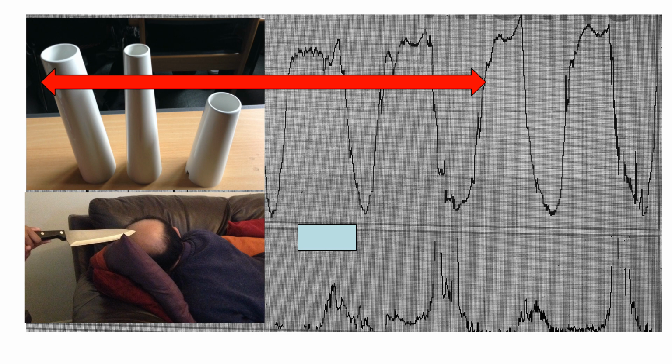This is because many years ago, it was believed by some obstetricians that the skin of the scalp was very close to the fetal brain, and therefore if you take a sample of blood from the skin of the scalp, it reflects the brain oxygenation. Some believed that by doing a fetal blood sampling, they were reducing the cesarean section rate. But in the gym, when you start exercising, the calf muscles develop acidosis. And therefore, if you take a blood sample from a peripheral tissue like muscle or skin, it is going to show acidosis, and that's going to increase the cesarean section rate.